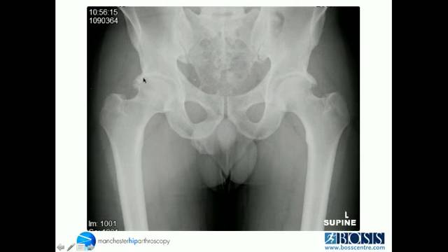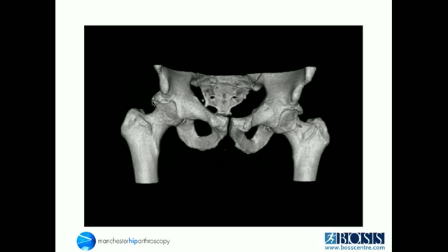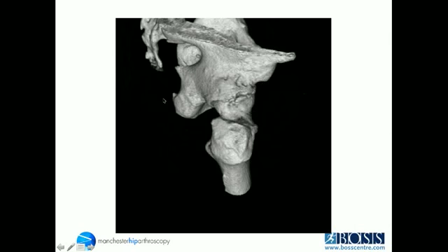And this is quite an unusual patient. He had gross ossification of his labrum, although still well-preserved joint surfaces, and he was only in his 40s. And this was the CT scan showing it bilaterally, and that's often the case. You often do have the deformities on both sides, but because one leg tends to be the dominant leg, that tends to be the one that's the most painful, and again showing the abnormality all around here, and this is all grossly abnormal.